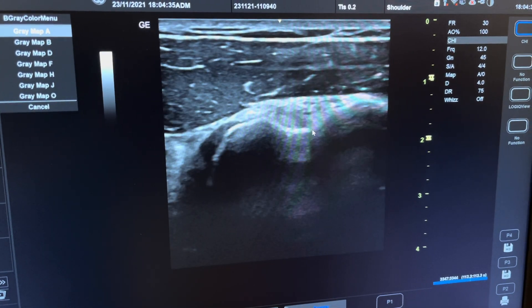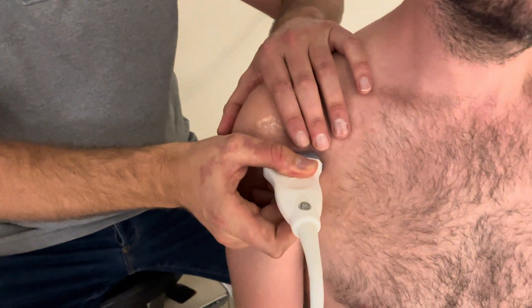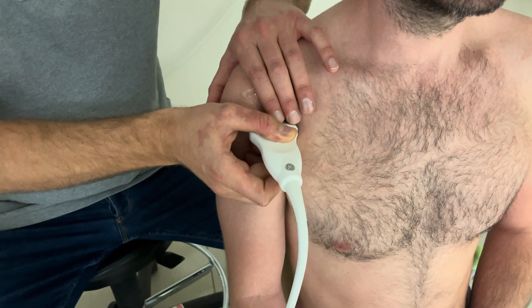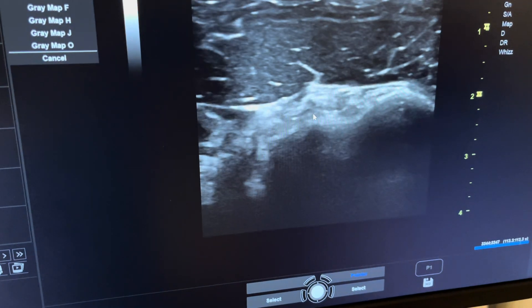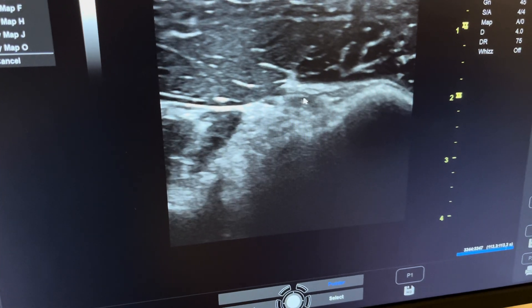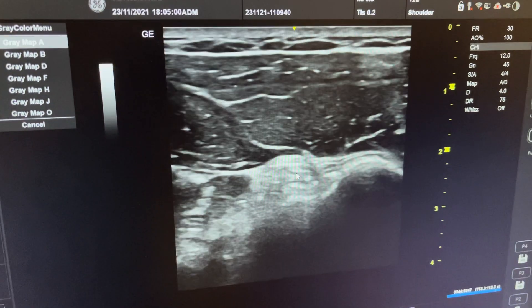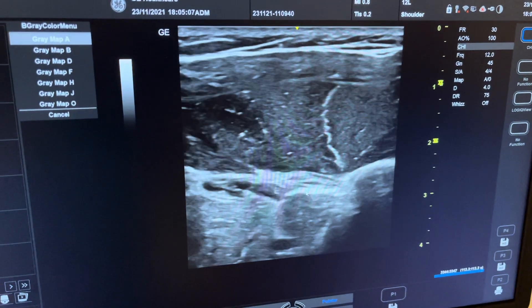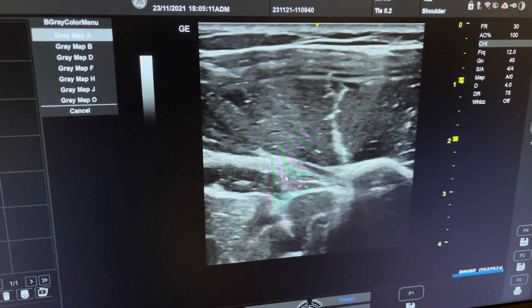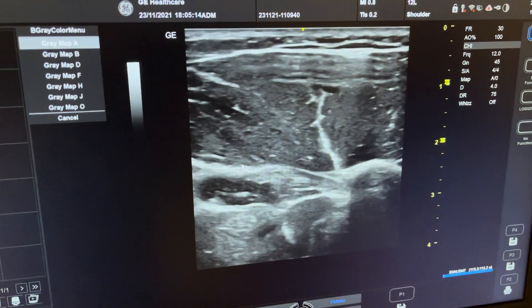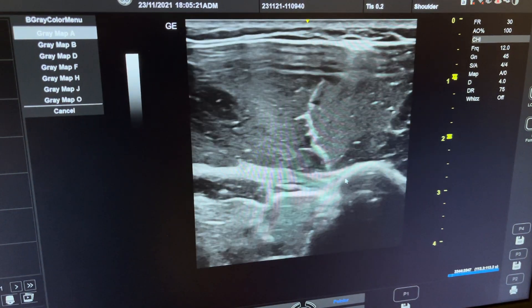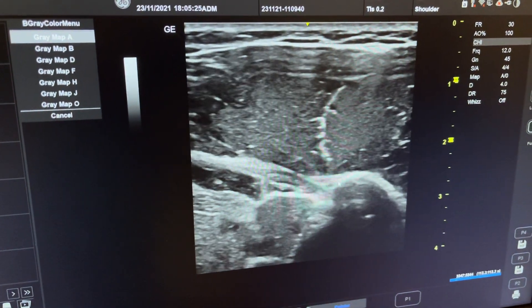Now we're inside the intertubercular groove and we go distal. Important: scan from a slightly downward angle, not upward. As we go down, we see on the screen that the intertubercular groove starts to disappear — becoming less and less prominent. We follow the tendon further down until we see a tendon coming in from the left, crossing over — that is the pectoralis major tendon inserting on the humerus, usually with a small bony prominence.